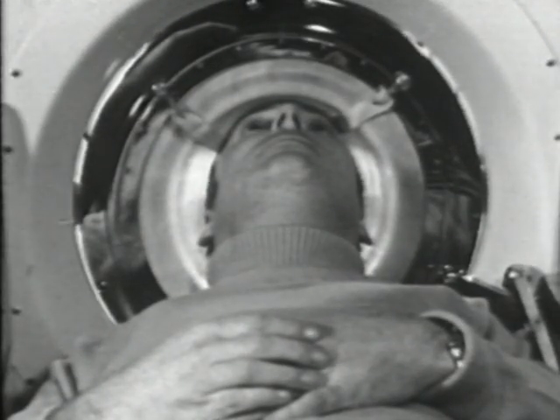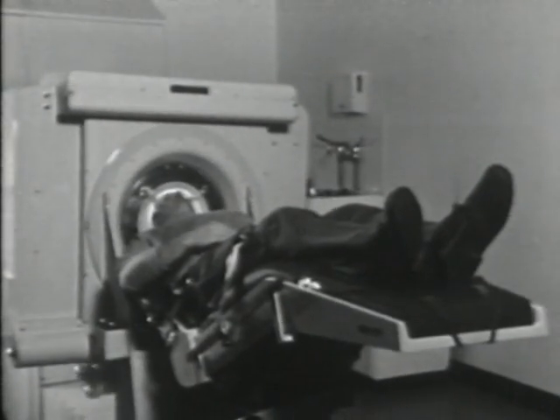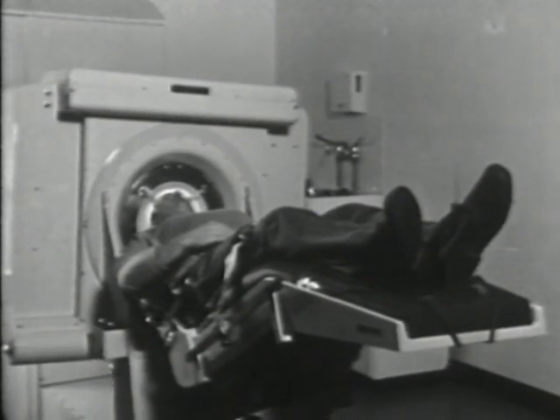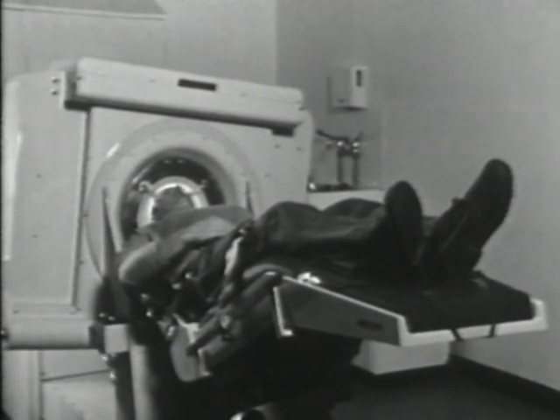Now let us look at the EMI scanner and see if we can explain the method employed. With this apparatus, the cranium is regarded as a series of contiguous slices, each made in the transverse axial plane. Each slice is scanned in turn using a highly collimated X-ray beam and an equally collimated system of crystal detectors.